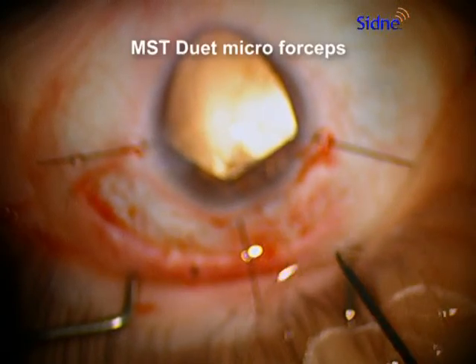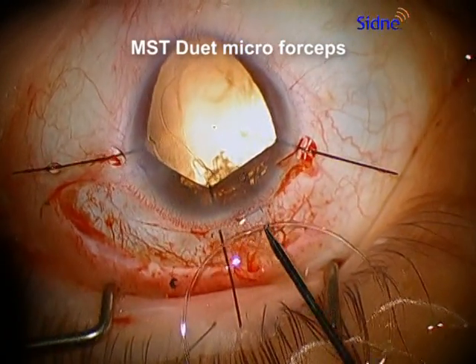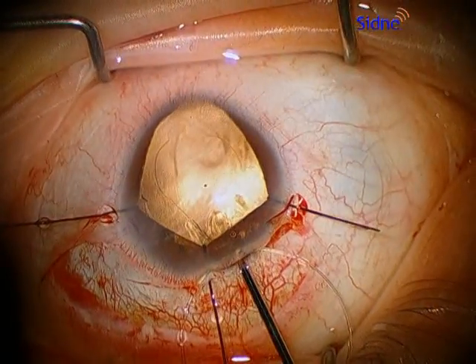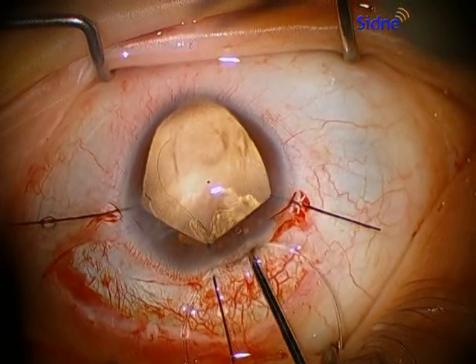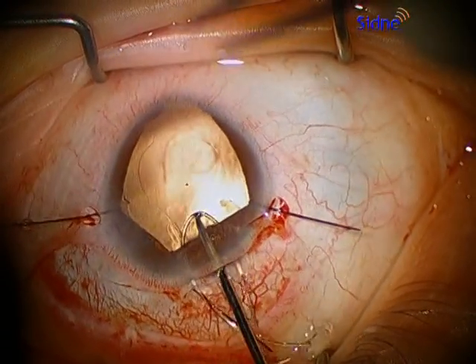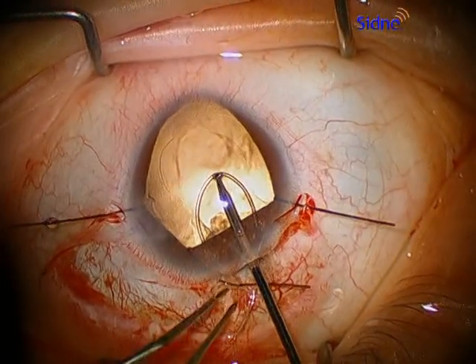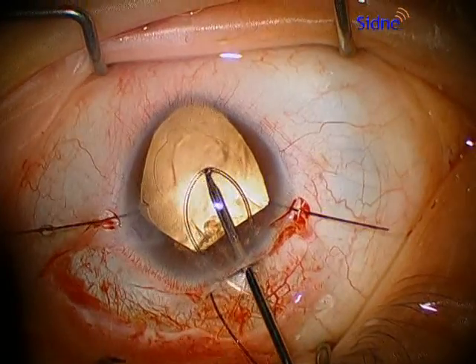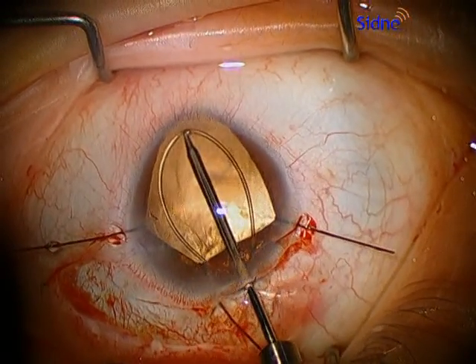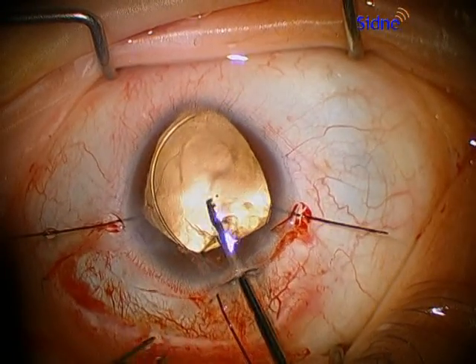Here we're using a duet forcep from MST and we grab it right in the middle of the capsular tension ring. We place the capsular tension ring by pushing forward, releasing a little bit of tension on either side as Dr. Little has showed us with this fishtail technique, and then going forward so that it looks like a little fish, then placing the capsular tension ring into the bag very carefully.